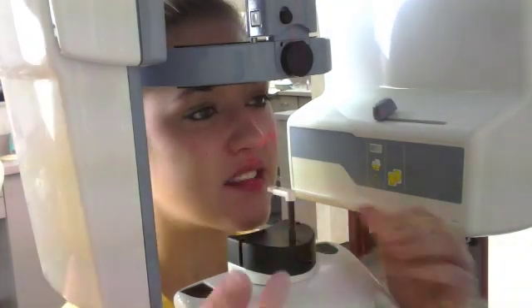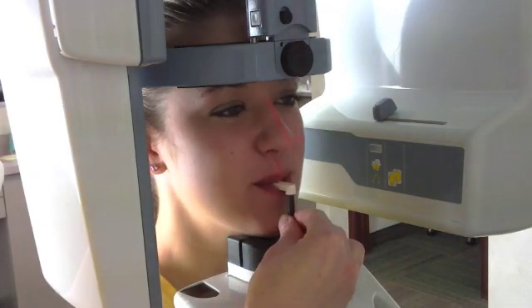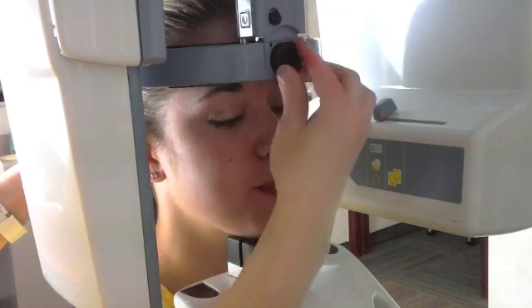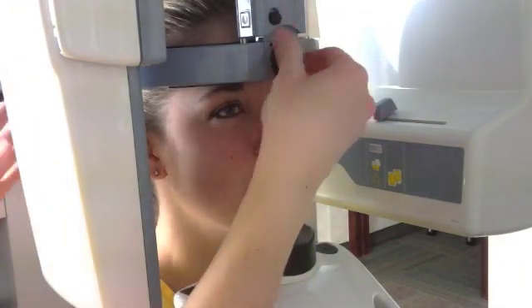We're going to show you how easy it is to take a digital panoramic x-ray. First, we have the patient bite on this little white tab, then we press this against their forehead and tighten the sides so we're nice and centered in the machine.